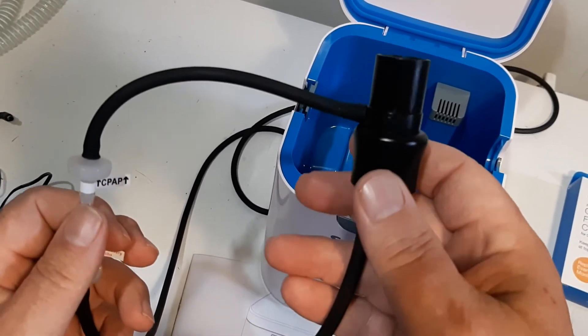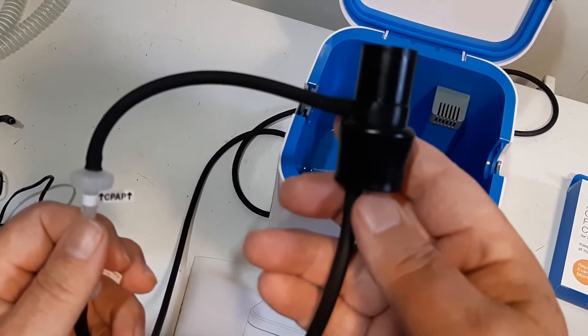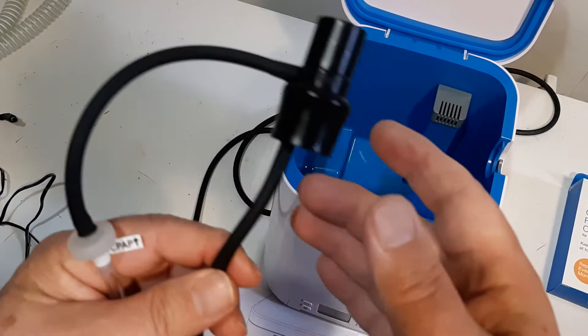Check on Amazon or check your local health supply store and they'll set you up with the right adapter for your CPAP machine.